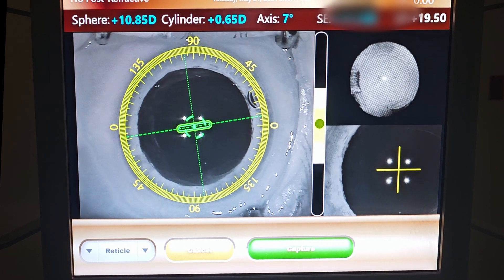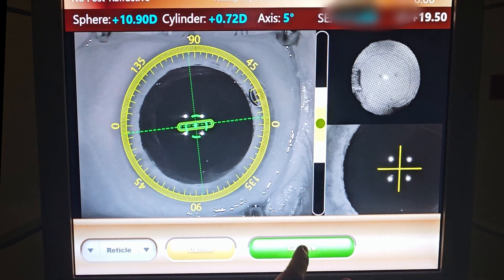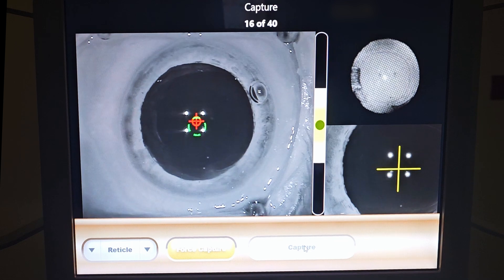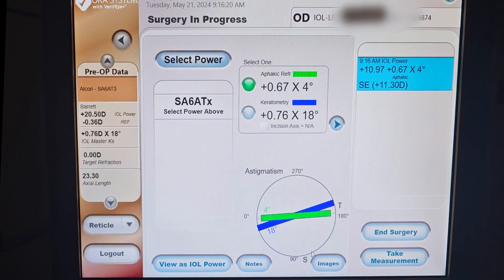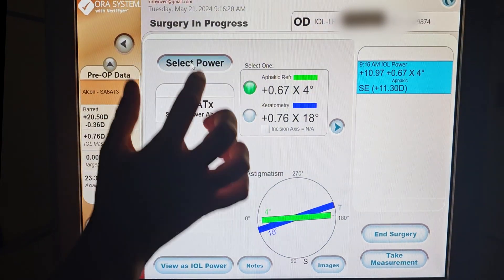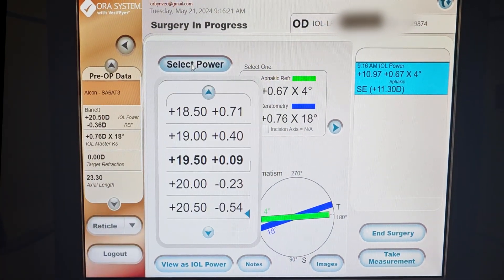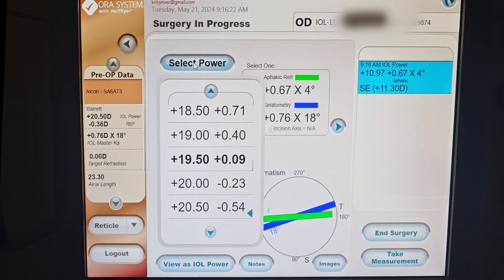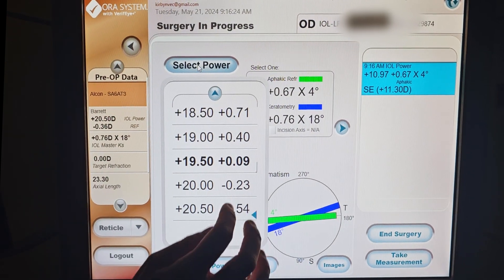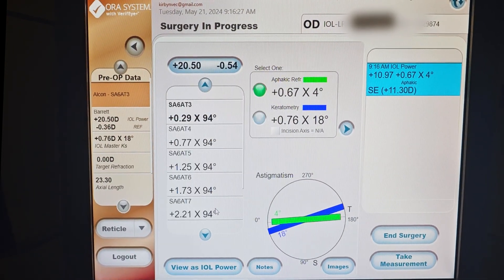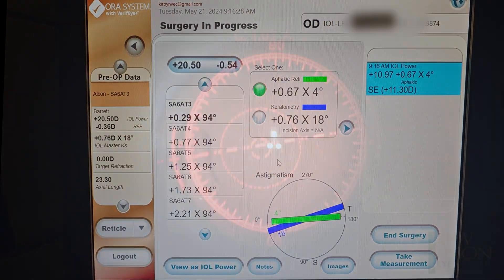Here we see real intraoperative footage of the computer system being used to determine the proper alignment of the lens. The system gives lots of information about proper lens strength that should be used, rotation that should be aimed for, and the astigmatism correction that would likely be needed.